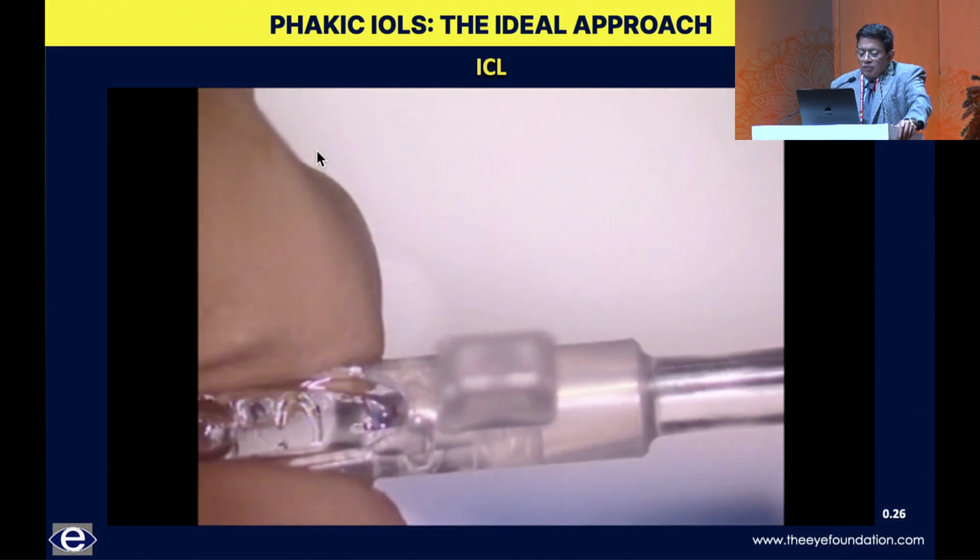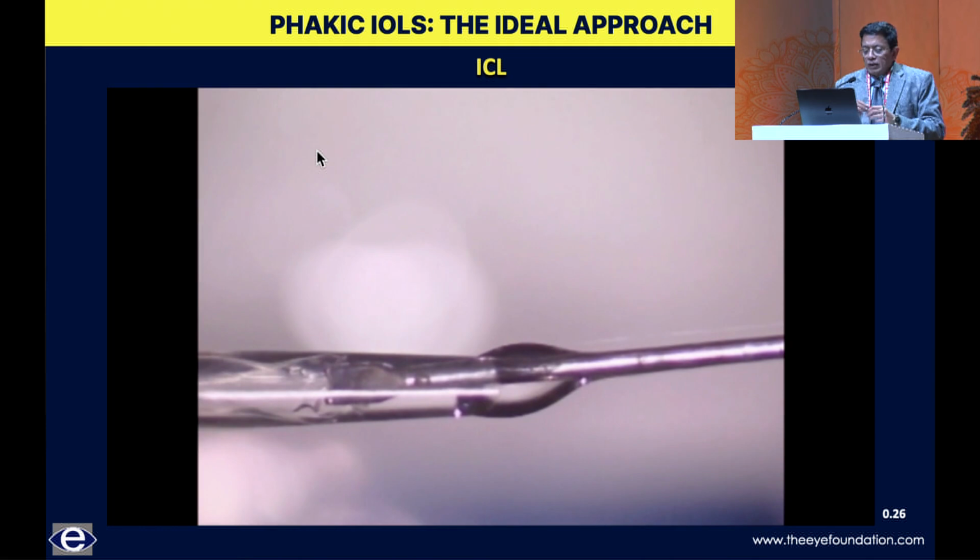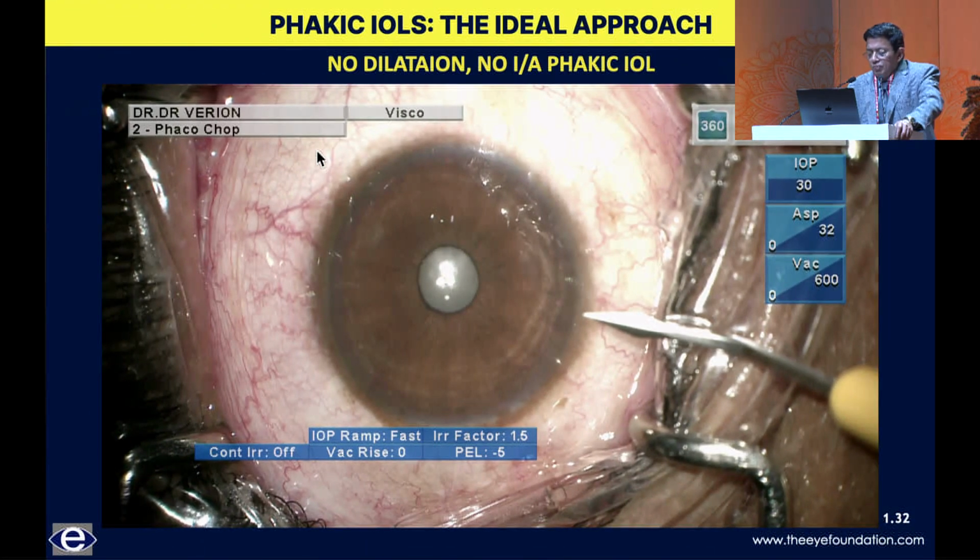After the placement, you use a front loading forceps to gently draw it forward. Actually, you pull the cartridge back and the lens should come forward, almost brought to the edge and left there. This is a couple of modifications that I've been doing for the last 2-3 years. I do not dilate my pupils before the surgery, because with years of experience in phacoemulsification, very rarely, while making the incision, there is a sudden touch of the anterior capsule. It's no big deal in phaco because you can include it in the capsulorhexis, but in a phakic IOL, fortunately it has never happened to me, but just in case it happens, that will be the end of the case because the lens would be damaged.